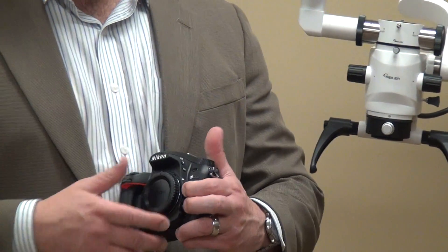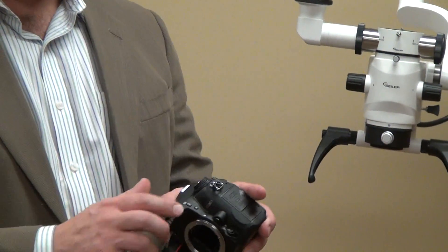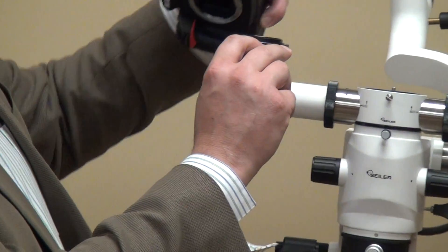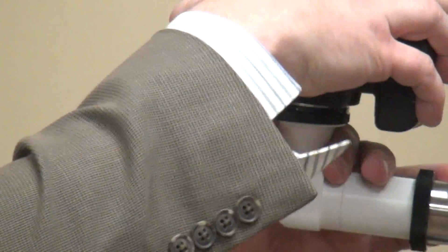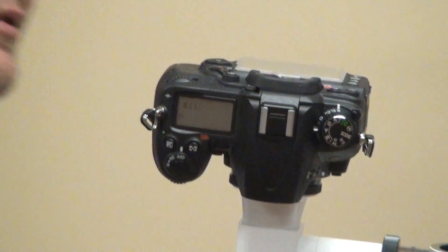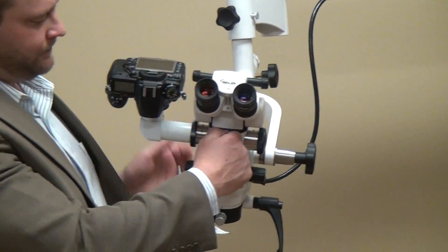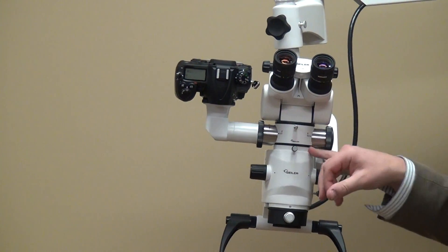All you do is remove the cap on the Nikon. You're going to have a little white mark on every single one of these DSLR cameras. We made a white mark on our digital adapter — line up the white marks so that it fits firmly, and then just rotate until it snaps. Then you'll have the 0 to 220 degree head, and you have your digital camera lined up to the microscope.